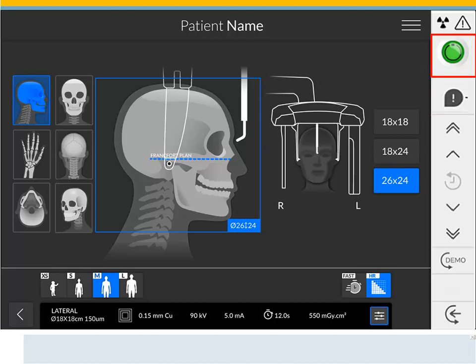Ready Indicator: black indicates the unit is not ready to start acquisition; orange indicates the unit is preparing for acquisition; green indicates the unit is ready to start acquisition. Warning will illuminate if there is an issue with the unit or if special attention is needed — check the user manual if this icon is illuminated. Ionizing Radiation warns you about radiation dangers: blue indicates the X-ray is enabled, gray indicates the X-ray is not enabled.